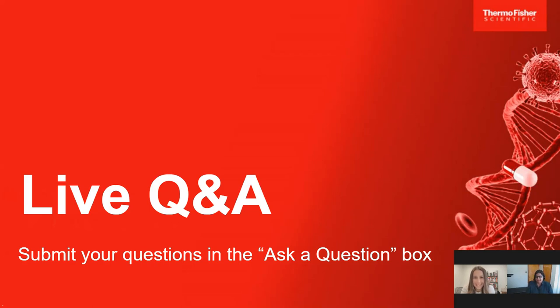Great, thank you. Next question here. How long do slides need to be left to dry before imaging? Yeah, so my recommendation is, after mounting, leave your slide at room temperature in the dark for 6 to 8 hours.